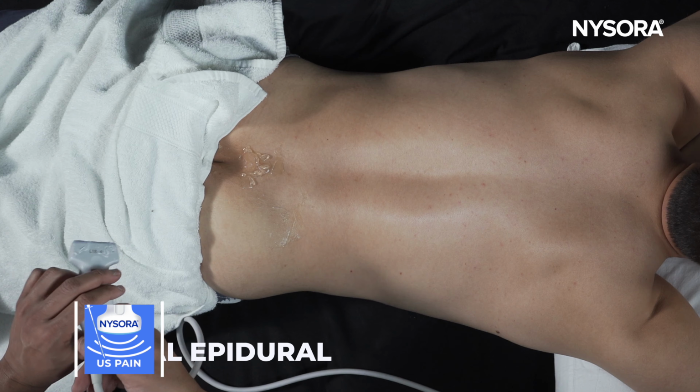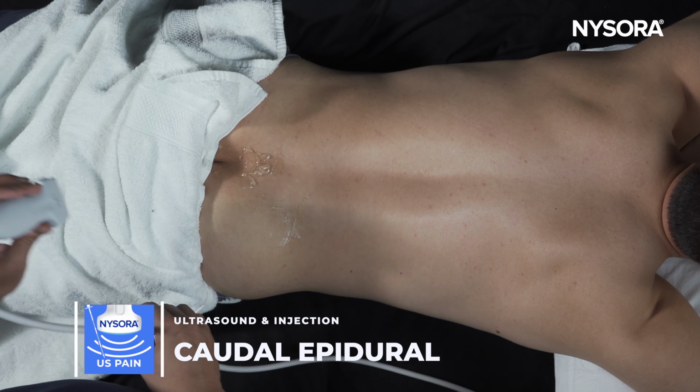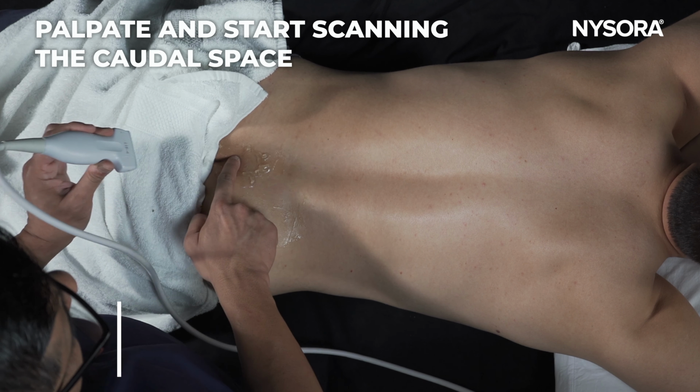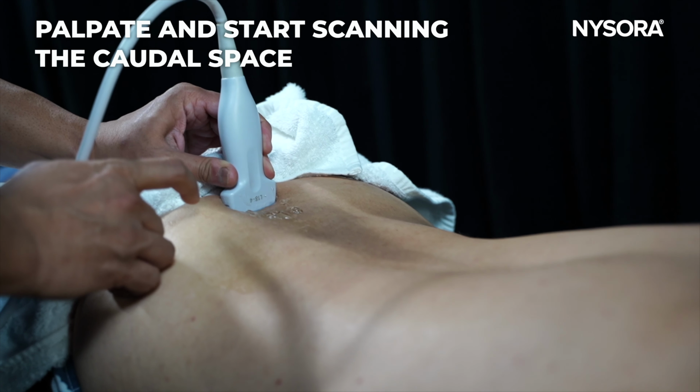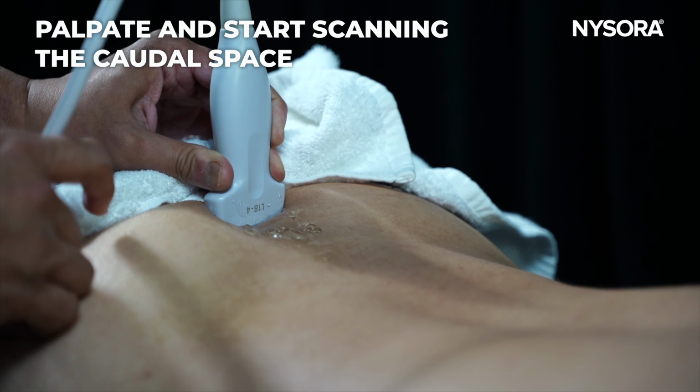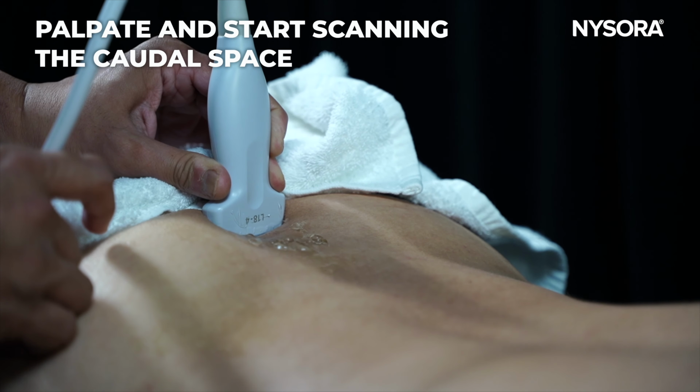I'm going to show you how to scan for the caudal epidural using ultrasound. You could palpate for the caudal space, and then you can put the ultrasound probe on the top of this caudal space. That's another good way to actually get to the structure quickly.